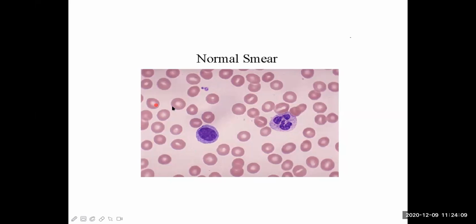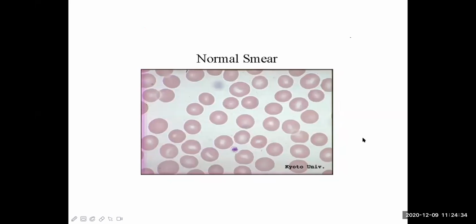And what are these cells which are in a very high number? RBCs, erythrocytes. Exactly. These are RBC or erythrocyte, and this small clump, they are the platelets. Let's move on. Look at this, another one. These are again different RBCs. This is a clump of platelets.